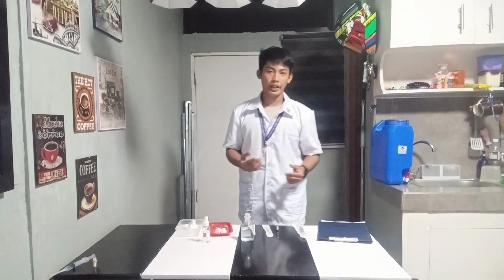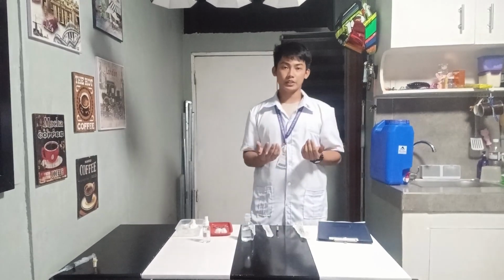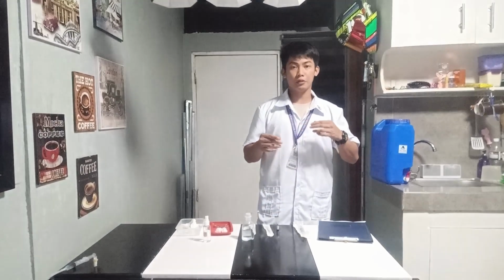Now withdraw the medication. The first thing we have to do is place the ampule on a flat surface, and then we have to attach the filter needle to our syringe firmly and remove the cap.